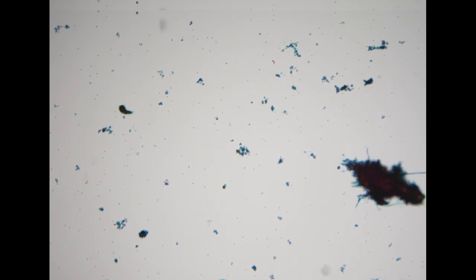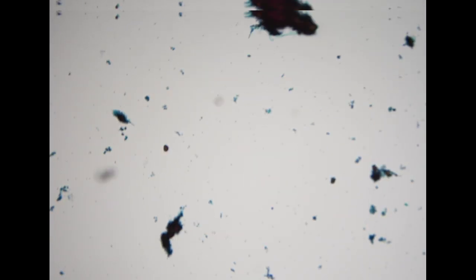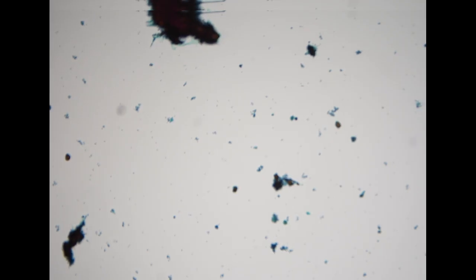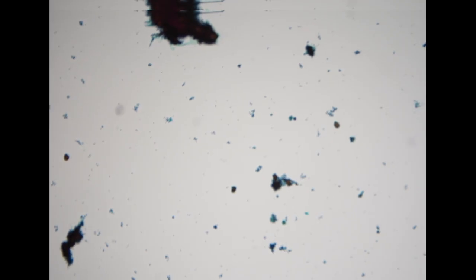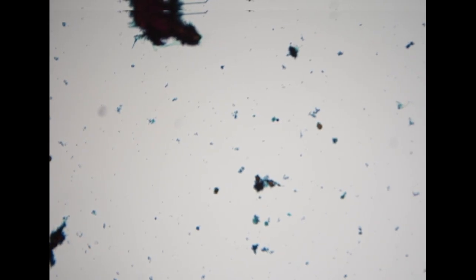The next specimen is a thyroid aspiration specimen, 53-year-old female. The patient visited us last year, and we already signed out her prior thyroid FNA as suspicious for follicular neoplasm. She has a big nodule in the right thyroid, around 5 centimeters.